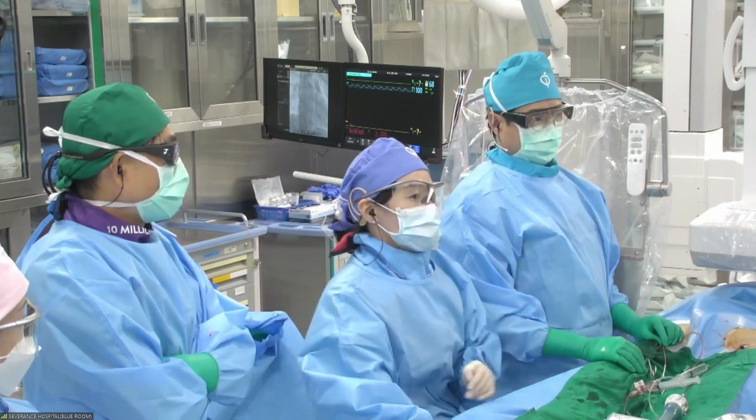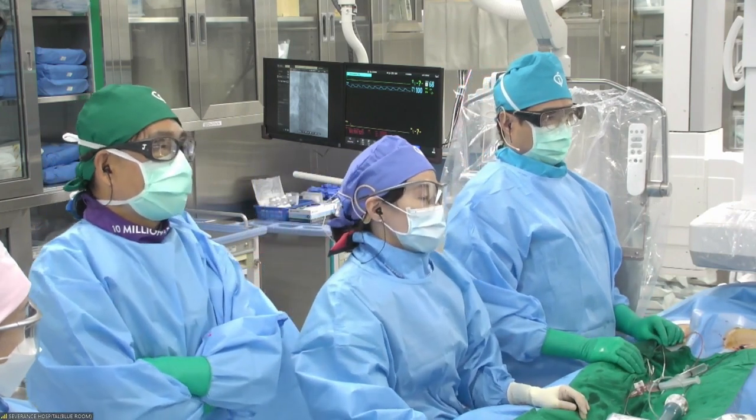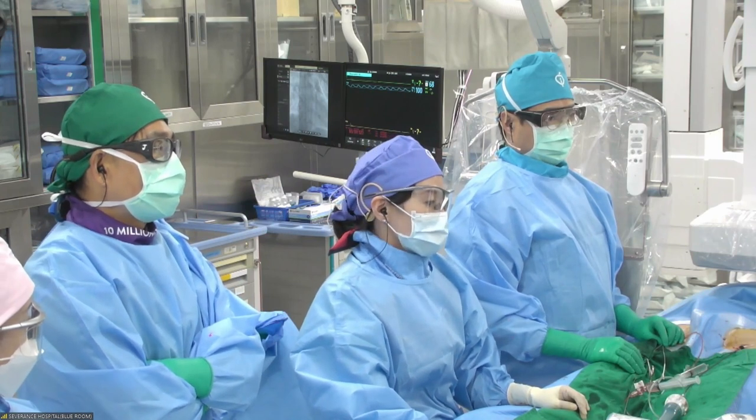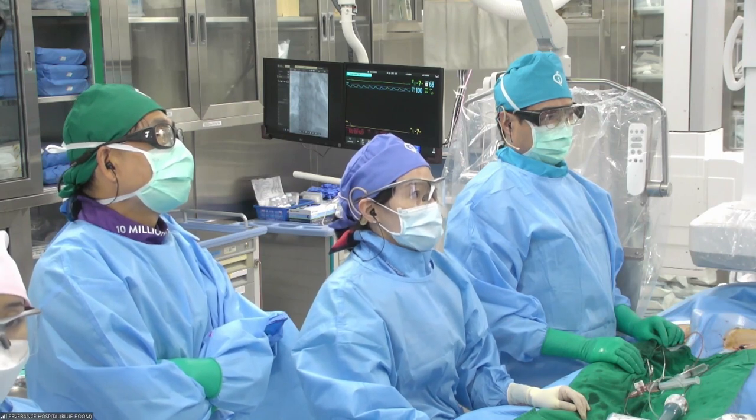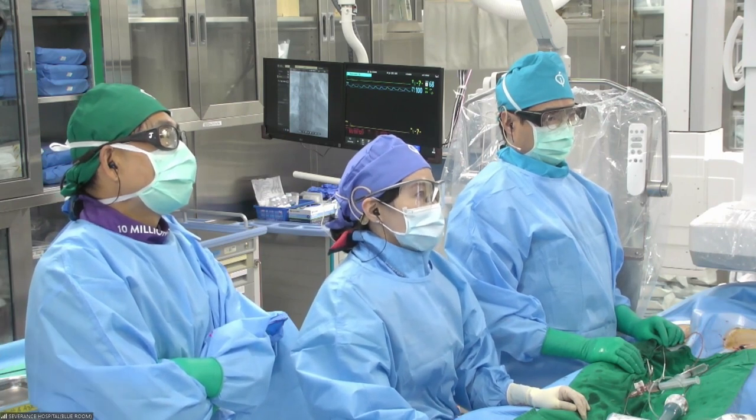Yes, we checked the Qp/Qs and mean pulmonary artery pressure before. It showed mean pulmonary artery pressure of 20 millimeters of mercury, a mild pulmonary hypertension.